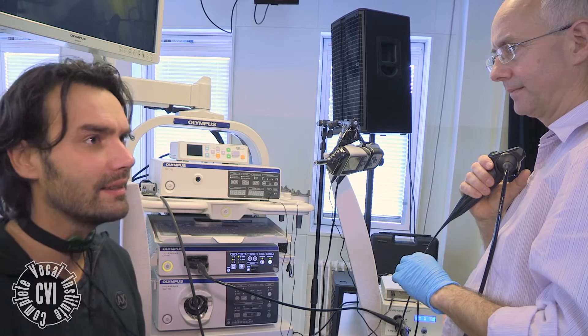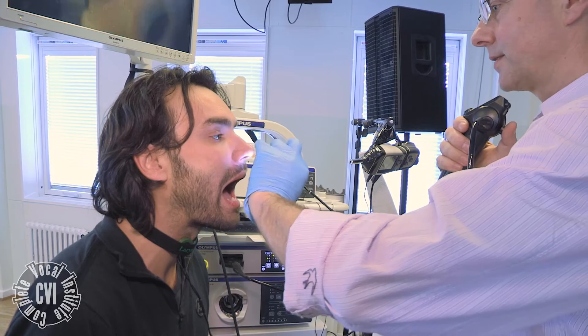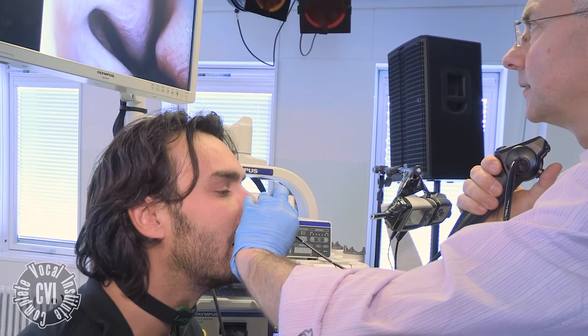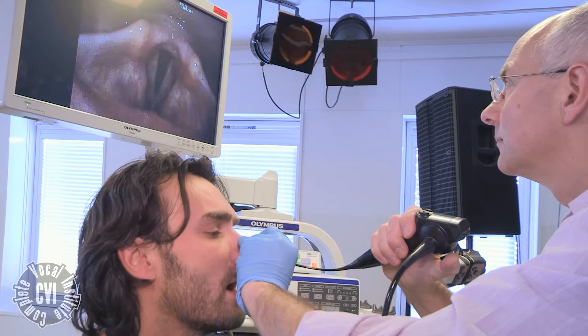The other one is passed through the nose. It gives very good images but not quite of the same standard as the rigid ones. But the advantage of that is that we're not limited to vowel sounds — we can examine the singers when they're actually singing musical phrases, and it's not so restrictive for the singer. In some cases it's better tolerated.